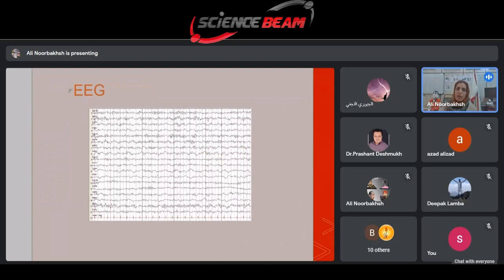As you know, by looking at EEG, you can see which frequency band has increased or decreased. But we cannot get the numerical value of each frequency band, while the brain map shows us the value of the frequency band with numbers.